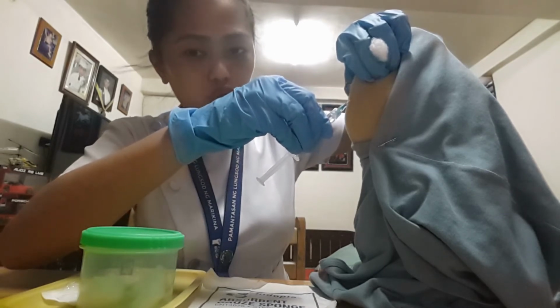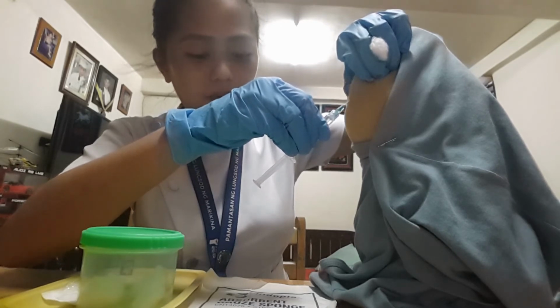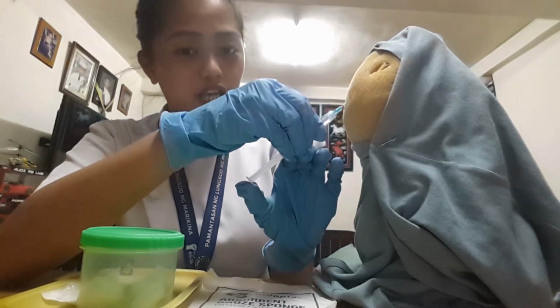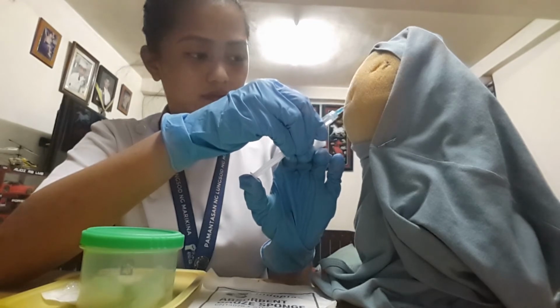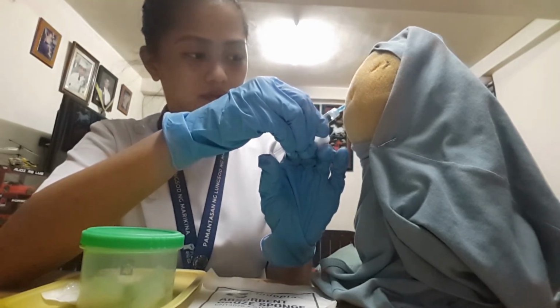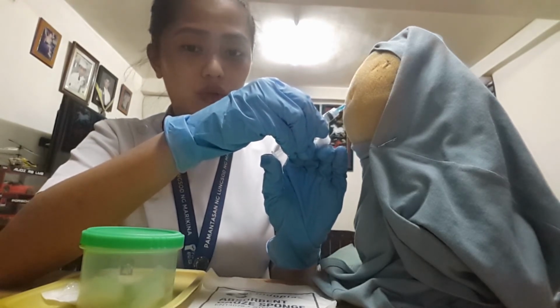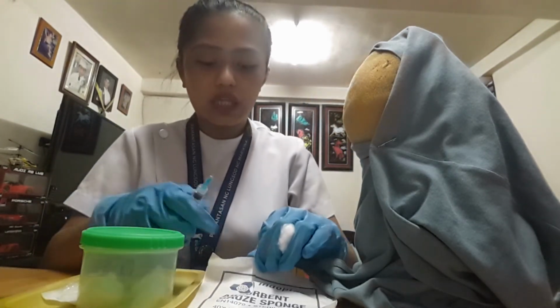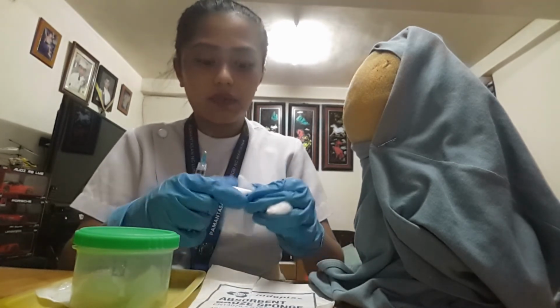After that, I need to remove my non-dominant hand and place it on the plunger and inject the medication. And the next is I need now to remove the needle carefully. Alright. So next we need to apply gauze if bleeding occurs.